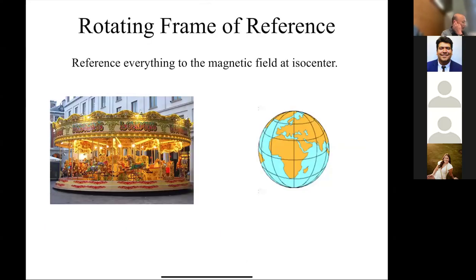The other, probably the last big concept we're going to put in today is, even though the spins are moving around, for example in a 3 Tesla field, they're going at 127 million cycles per second. That's sort of complicated. That's the laboratory frame of reference. But it's much simpler if we consider what's called the rotating frame of reference. Essentially, we're going to imagine we're in the same frame of reference as the spin, so we're going to move around with the spin.